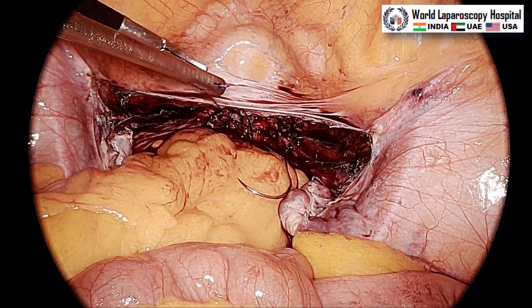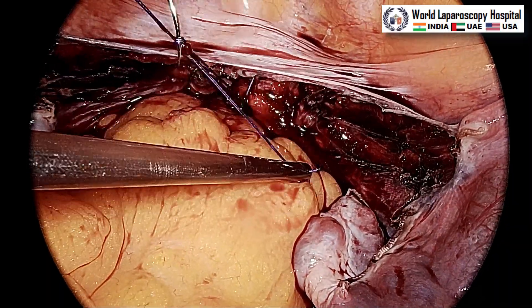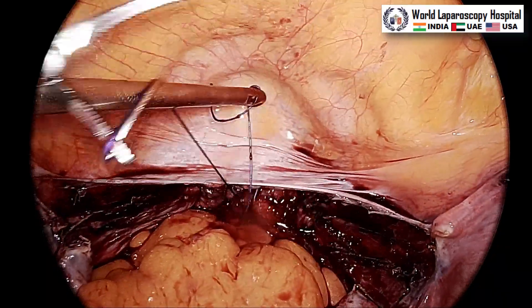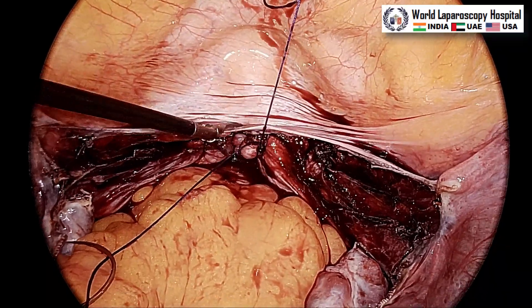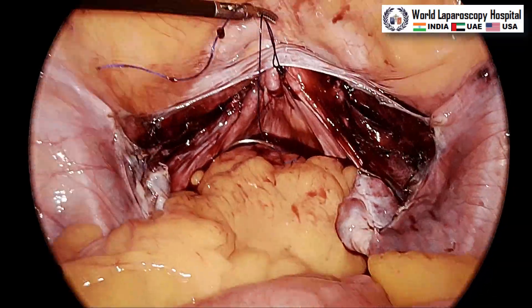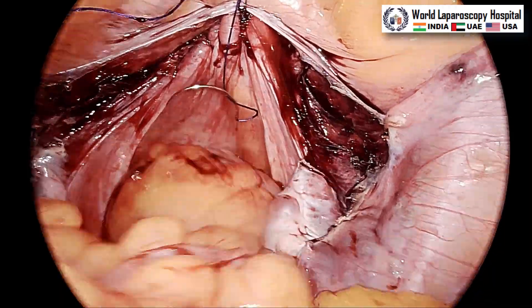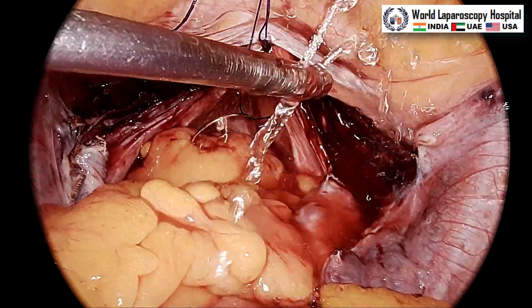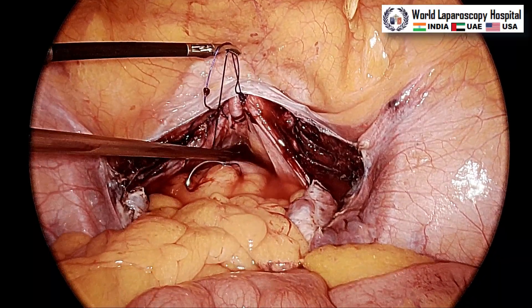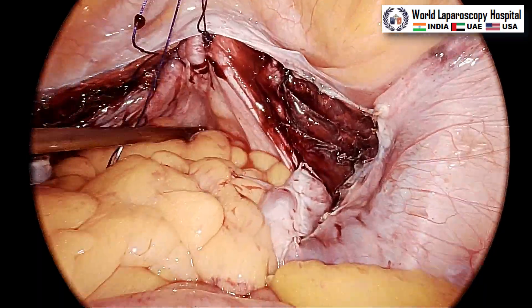If the tail is very big, take a bite with the tail, catch the suture near the needle, and pull the needle out. Alternatively, cut the needle near the suture and take the needle end to make a C and reverse C. Suturing of the vault is very easy — just continuous suturing with one surgeon's knot at the end. Now let me show how to use the tail to take a bite, catch near the suture not the needle, slide the needle, and tie the final knot.